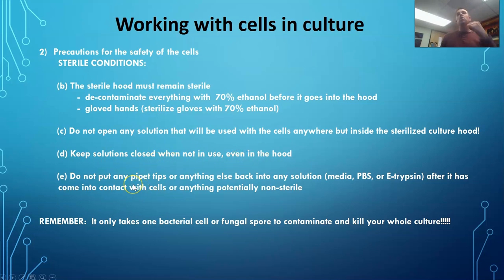And basically, know what you've touched. If you've used a pipette to suck up your cells, you don't want to go back into your stock of solution, because if you do, even if the pipette's empty, there's cells stuck to it. And as soon as you put anything that's touched cells into your media or your stock solution, well, that now has cells, and you're going to be able to cross-contaminate anything else you use. So once you've pulled up cells, do not go into your stock solution with that same tip.